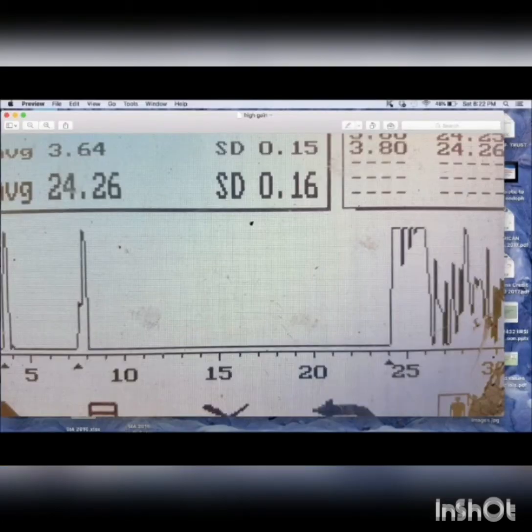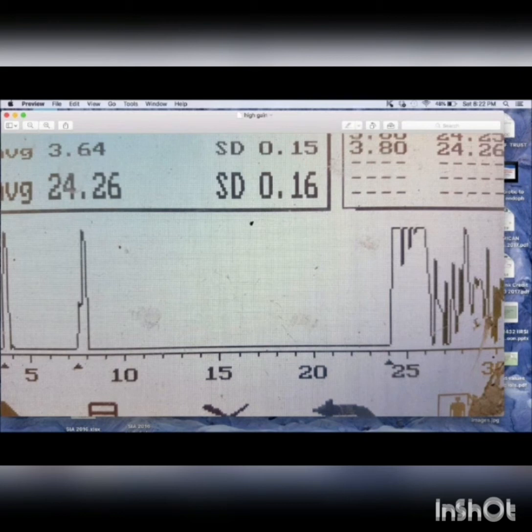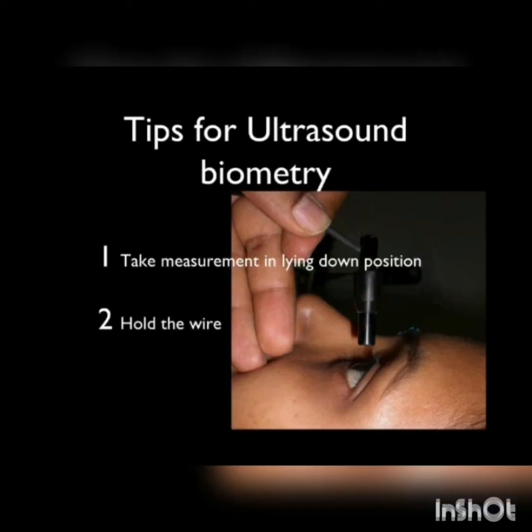Let us see what we can learn from the actual A-scan pattern in the review pane of the machine. Above the 25 mm mark, you can see the scleral spike and the retinal spike have fused into one solid spike — this means the gain is very high. Please lower the gain until you see two individual spikes: a retinal spike and a scleral spike, both arising from the baseline. Within the yellow circle, the letters 'AC' denote the anterior chamber depth and to the right is the axial length. Variable corneal compression can be identified by seeing variable anterior chamber depth.